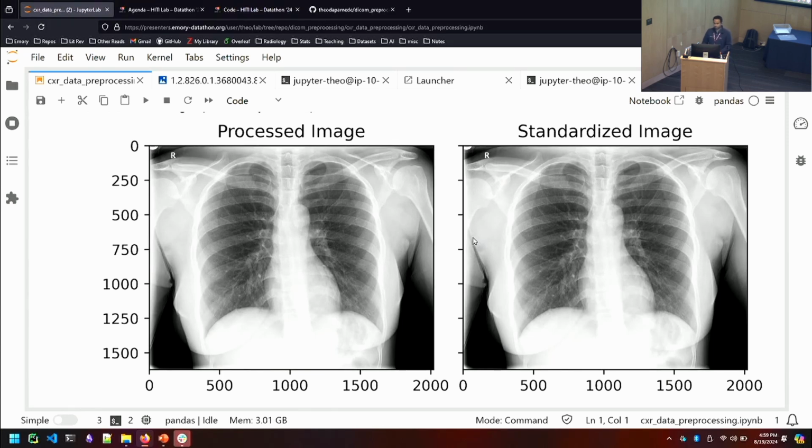Two more questions. There's one there. So I have one question. While doing the normalization, is it advisable to remove the black portion which is visible in the images, because those pixels are very high, so they might impact the normalization of the images?